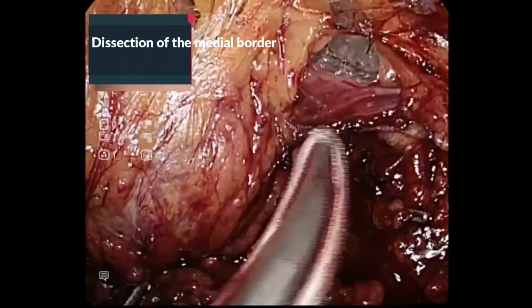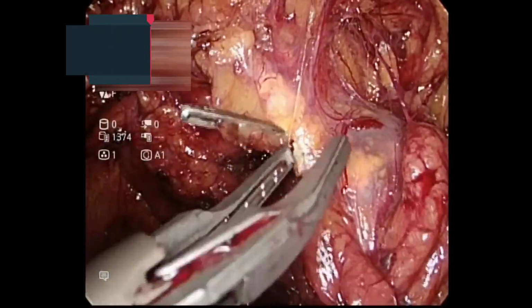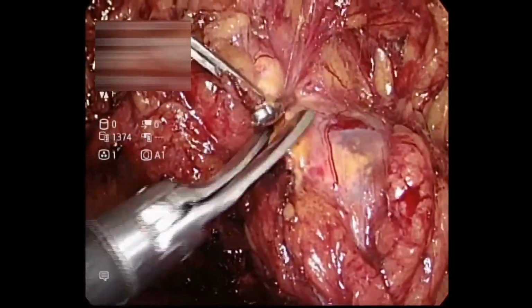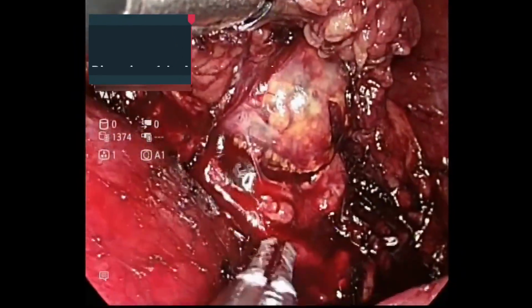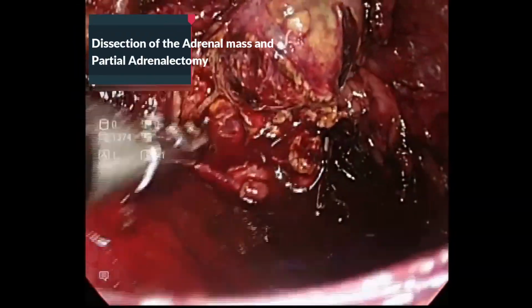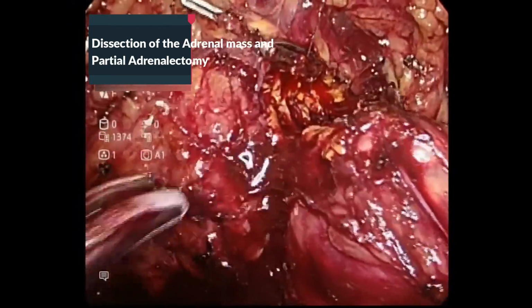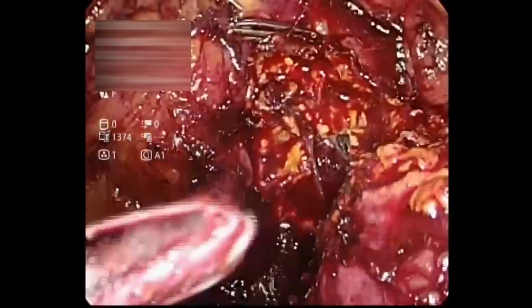This was then followed by the dissection of the medial border of the adrenal mass. The adrenal mass was then identified and dissected from the normal adrenal gland using ligating clips. Mobilization of the adrenal mass was completed using a vessel sealing device. It is important to avoid grasping the actual parenchyma because it is easily fractured.